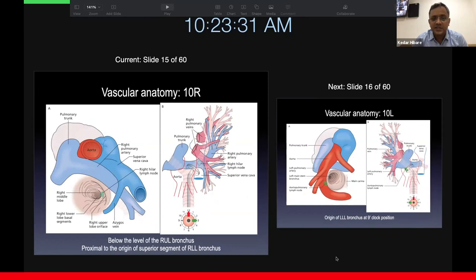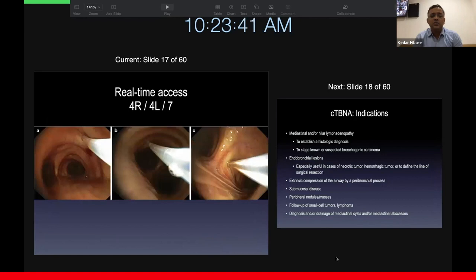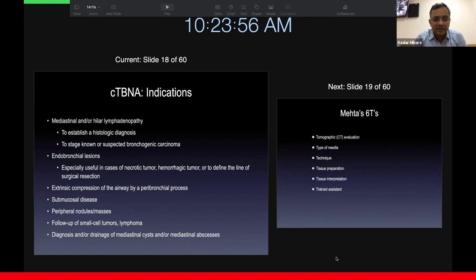For station 10R, you puncture at about 12 o'clock once you are at the entrance of the right main bronchus. This is how it looks in real time during insertion: on the left-hand side you see a 4R puncture, the middle photograph shows a 4L puncture, and the picture on the right side shows a subcarinal puncture.